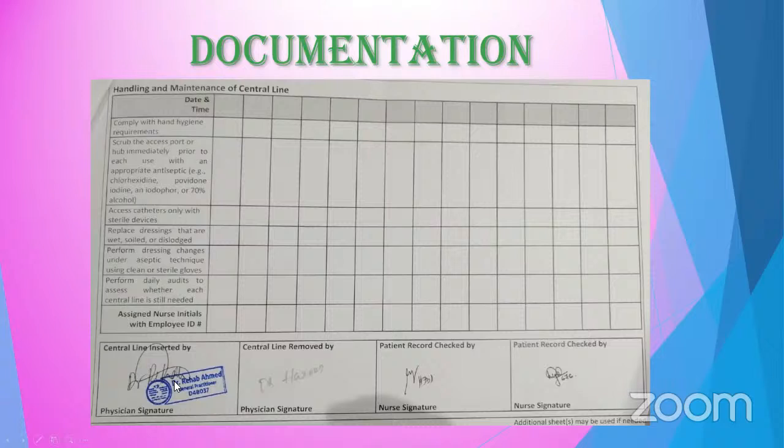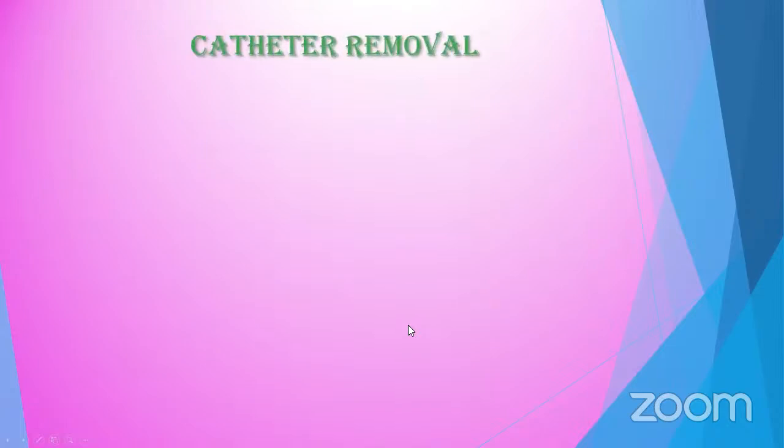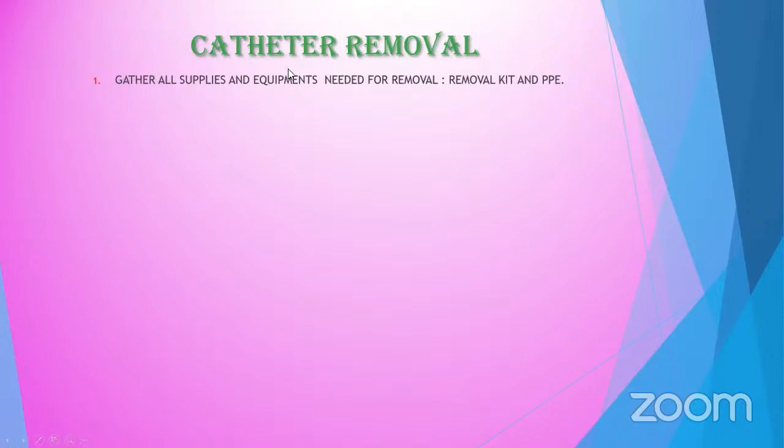Should be central line inserted by Dr. Rehab, central line removed by Dr. Haron, and then nurse should be signed here. Then catheter removal. So if we will remove the catheter, gather all the equipment needed for removal.